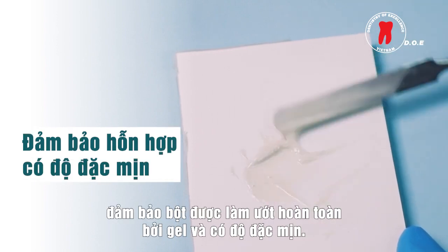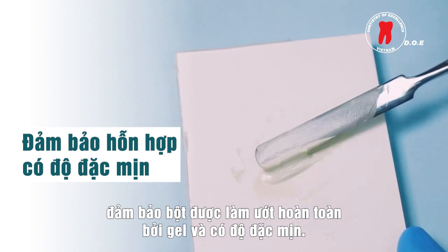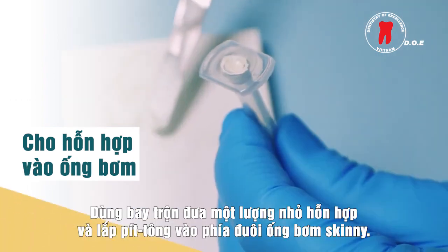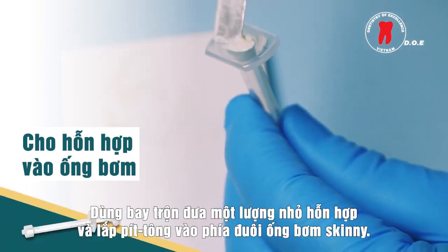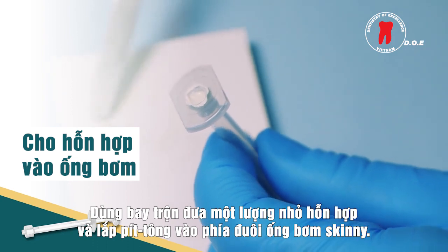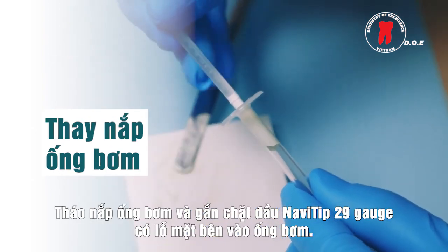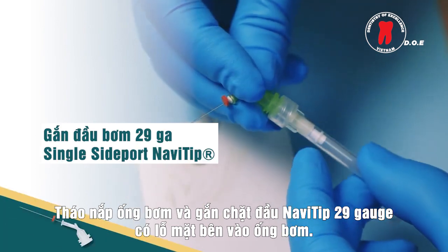Spatulate the gel and powder mixture to make sure the powder is thoroughly wetted by the gel and achieves a creamy consistency. Take small amounts of the mixture with the spatula and insert the sealer into the back of the skinny syringe barrel. Replace the plunger and attach a 29-gauge Navi tip single side port tip securely onto the syringe.